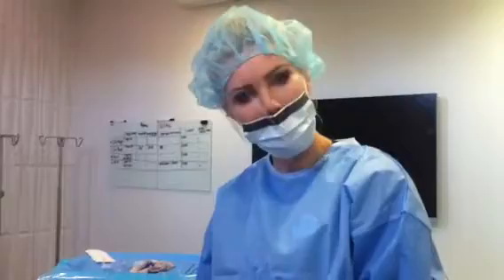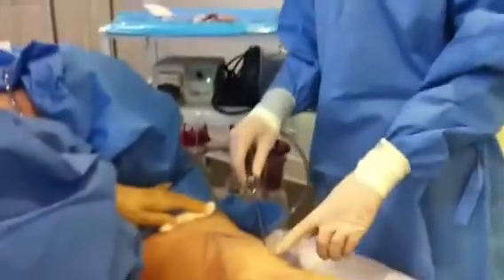In this particular patient, we actually did a little bit of laser treatment with the AcuSculpt laser to try and tighten the skin and melt some of the fat. And now we're going to follow through with a little bit of liposuction.